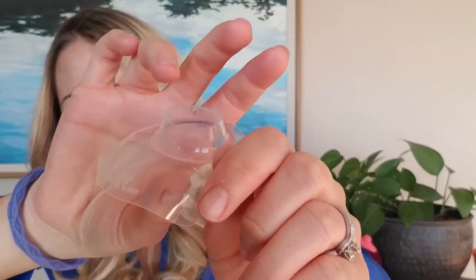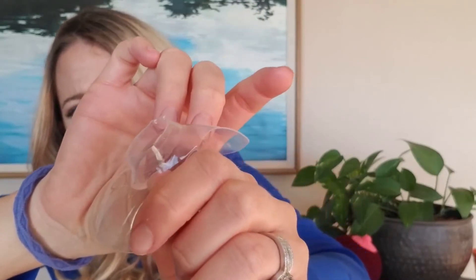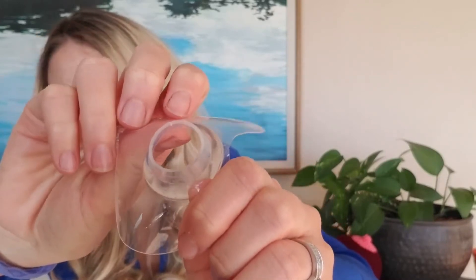Not only that, when you cut silicone — and let me show you this — it leaves sharp edges. It's kind of jagged; it's really hard to cut it smoothly. You can see it leaves the edges really sharp.